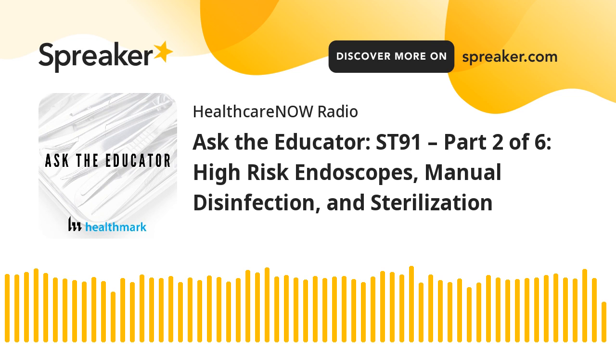And then I'll be honest with you, there are some facilities that just consider everything to be high risk. So they're all treated with the utmost care and to the same standard of care for all patients. And listen, that's fine to do. I would love if everybody thought that way, but that's not realistic in a lot of facilities. So always that group that I said, and any others that your facility might think are high risk. And then we want you to do something different with those.